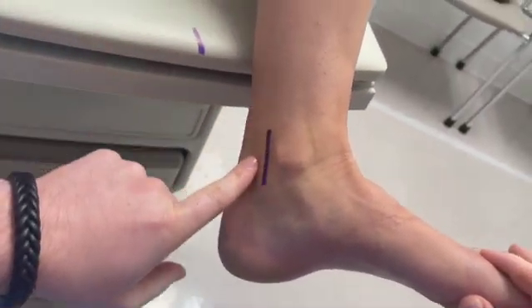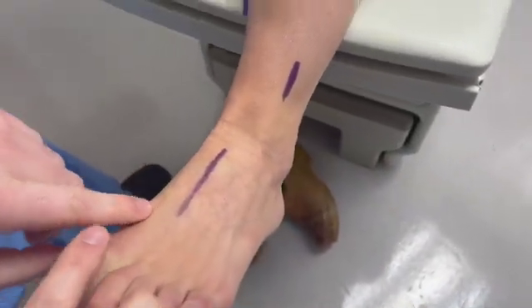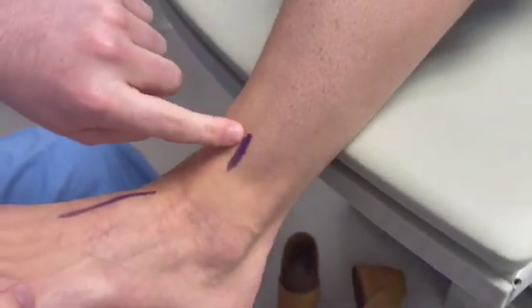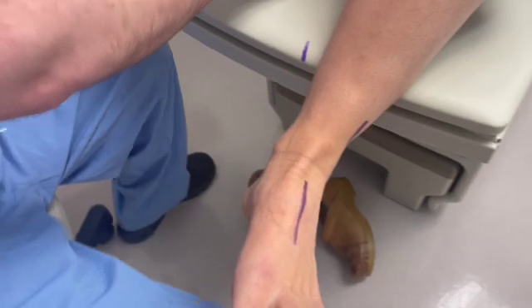We're going to look at three vessels. We have our posterior tibial artery, followed by our dorsalis pedis artery, and then our perforating peroneal artery. All three should be dopplered when you're doing your exam.